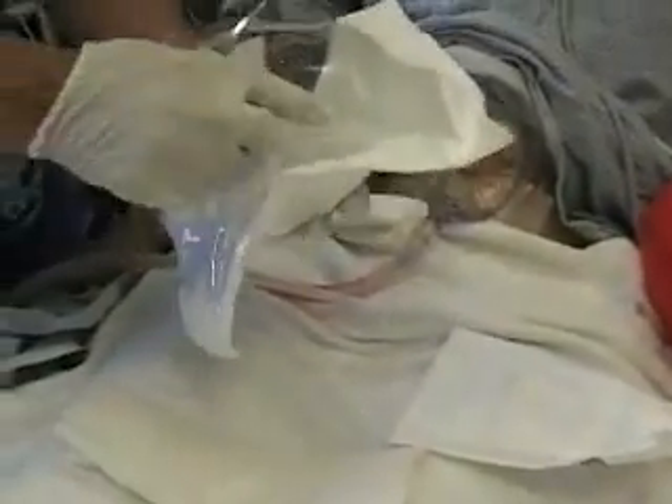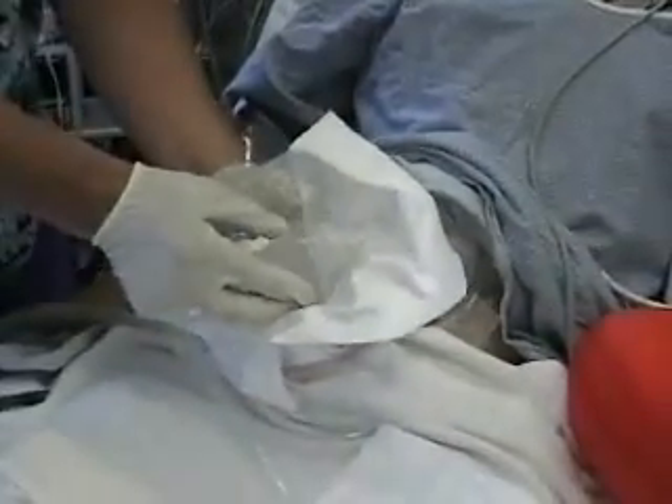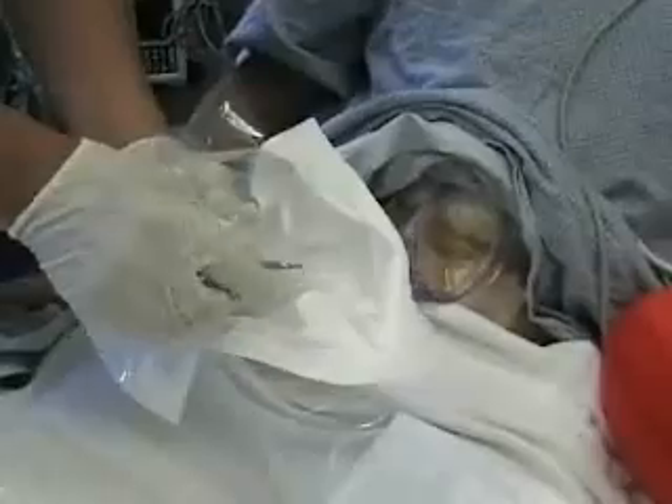These bulbs have a one-way valve. It's important that at the tip of this, you don't touch on to anything, because this is sterile. You have this here, which is the cap. You can cap it right in there, and that will not allow air back in, because we're going to connect this here to the chest. I can't push air in, because it's a one-way valve.